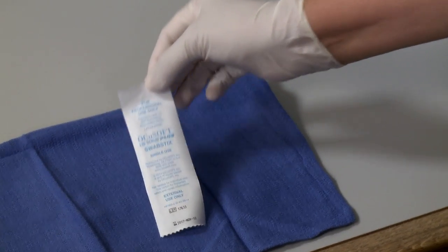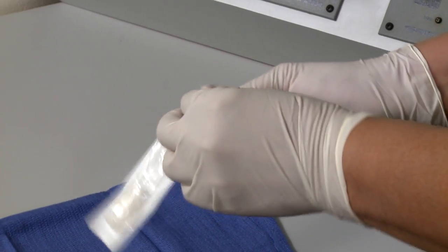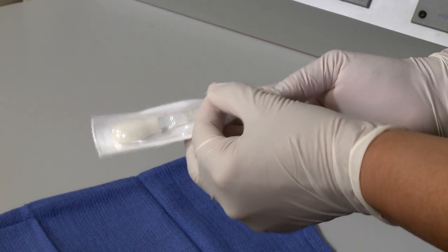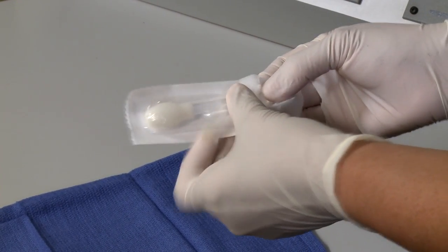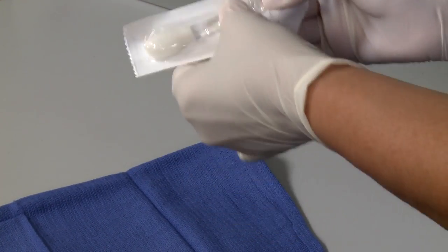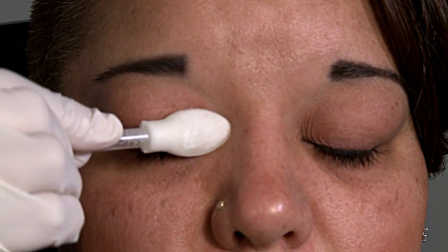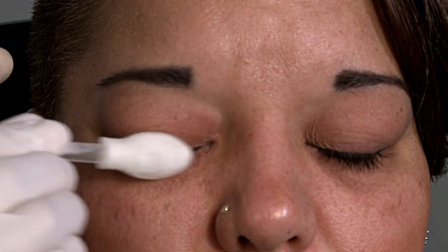To use, open OkiSoft Lid Scrub Plus swab sticks with handle side up. With the swab stick still in the package, press firmly on handle tip to saturate the foam tip. Do not bend the handle to try to break the plastic — just pinch and listen for the pop. With the tip of the swab stick, cleanse eyebrows, eyelids, eyelashes, and the inner aspect of the lower eyelid.